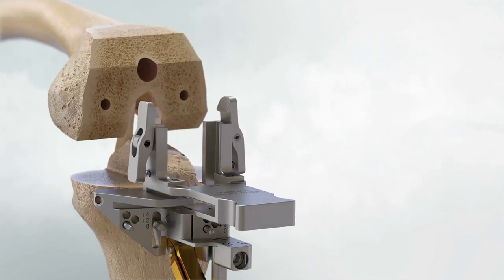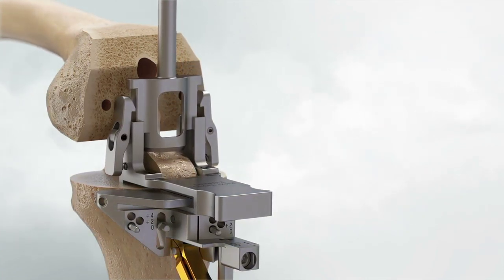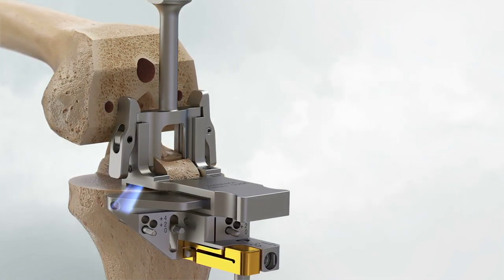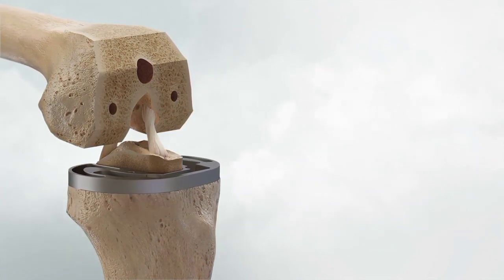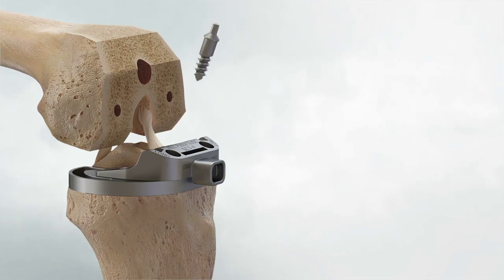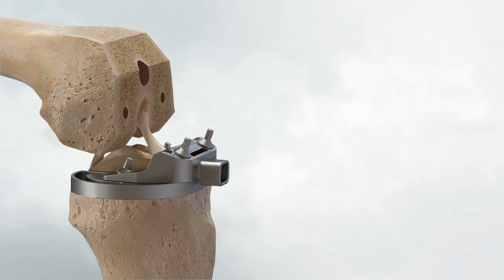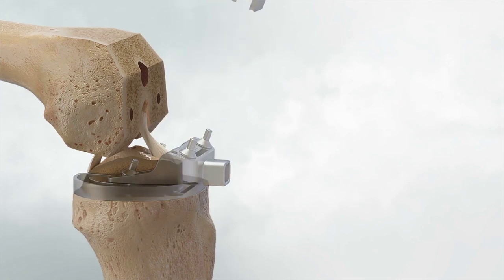Attach the anterior eminence chisel guide to the datum block and loosely engage the eminence chisel. Slide the eminence guide posteriorly as far as possible without resecting the ACL, and lock the datum block. Use the anterior eminence chisel to resect the anterior eminence vertically first, then finish the anterior eminence resection using an oscillating saw to complete the transverse resection. Remove the chisel guide, datum block, and pins. Place the appropriate tibial punch tray onto the tibia and ensure adequate fit and coverage. Attach the appropriate size tibial punch guide to the tibial punch tray, pin in the posterior holes using two 6 mm by 27 mm tibial speed pins, and secure using two 6.5 mm by 40 mm speed pins in the anterior holes. Using the appropriate size tibial keel punch, prepare for the keel through the tibial punch guide and tray. Remove all instruments from the joint and prepare to cement implants. It is recommended to use a curette or osteotome to clean out excess bone to ensure the baseplate implant will fully seat.